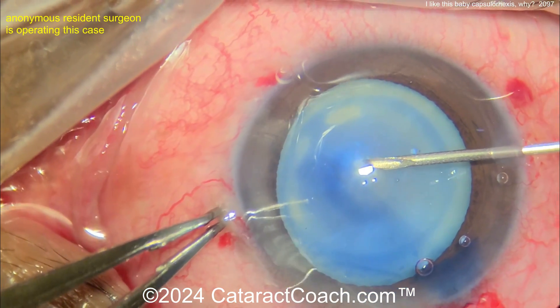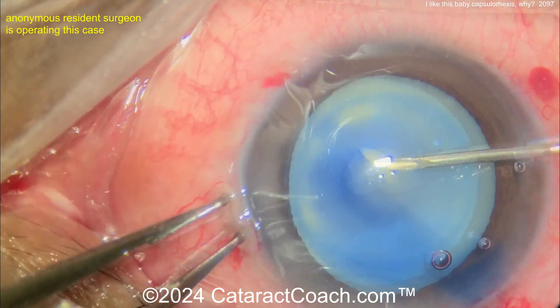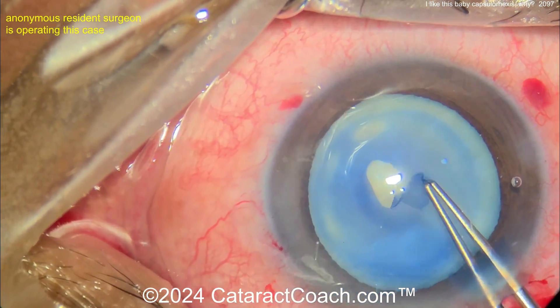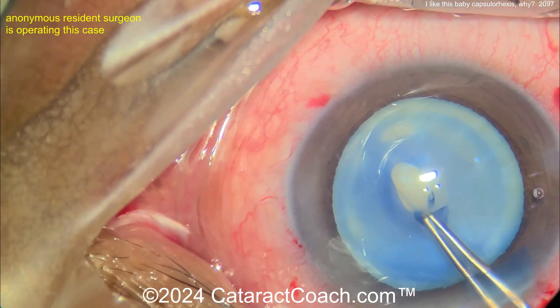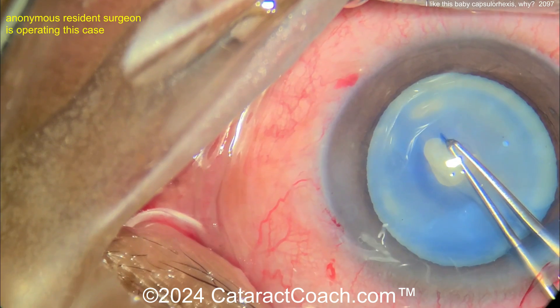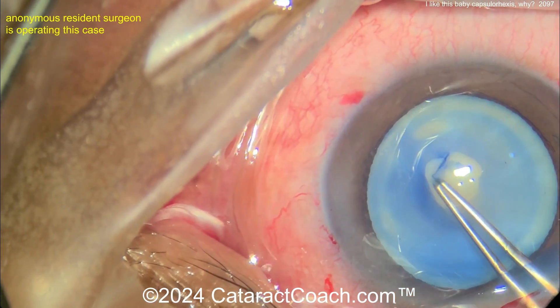Cystitome going in, and so the baby rhexis is part of the double rhexis technique. The idea is to make one small rhexis — it doesn't have to be pretty, doesn't have to be perfectly centered, it just has to be kind of continuous and intact. Once you get that first rhexis done, you can decompress the capsule bag because it's stable. There's no edge that's going to run out. Complete the baby rhexis — it doesn't matter exactly the size or even the shape, just make sure it's continuous. Beautifully done.